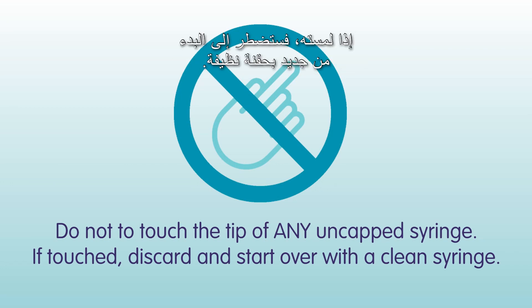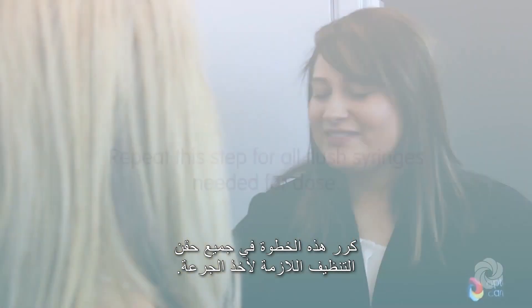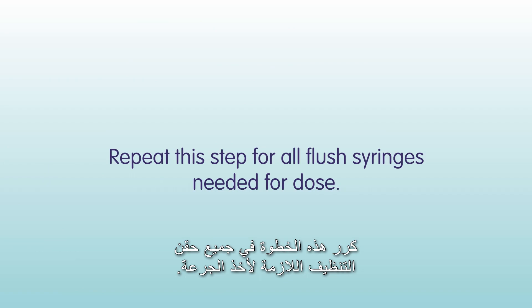If you touch the tip, you will need to start over with a clean syringe. Set aside the syringes until you are ready to use them. Repeat this step for all flush syringes needed for your dose.